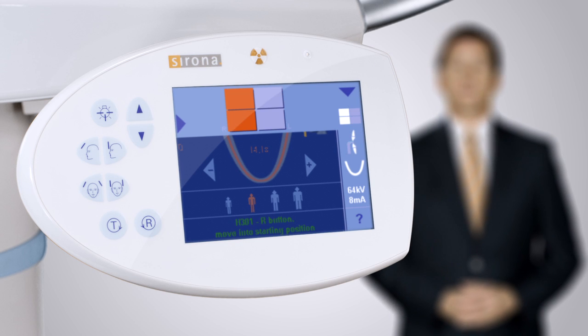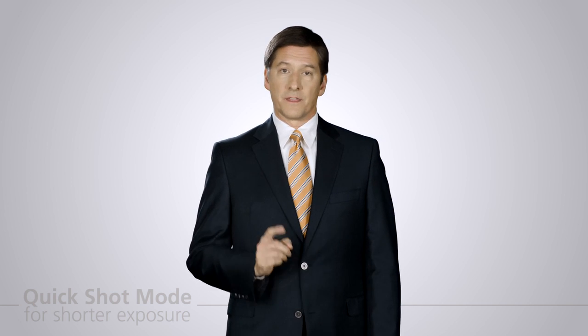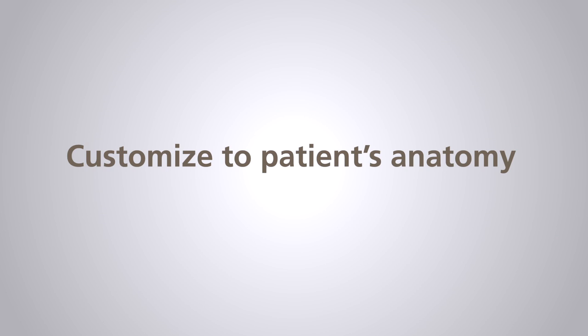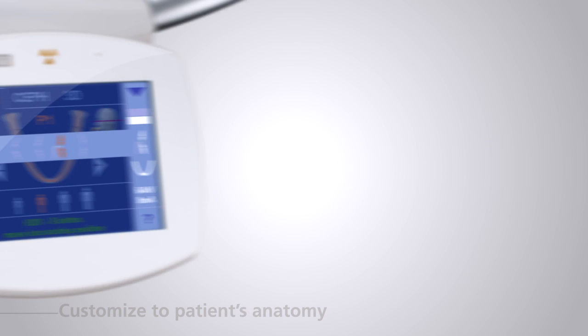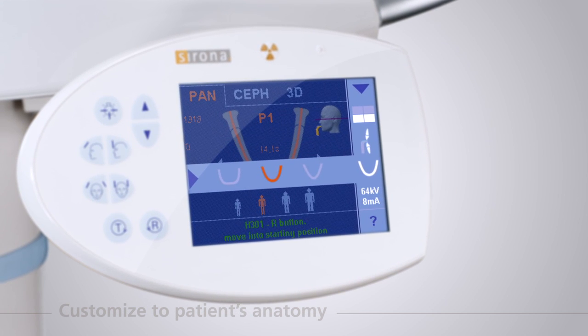The operator can easily select the quick shot mode on panoramic and cephalometric imaging to select a shorter exposure cycle, thus reducing the necessary effective dose to the patient without image quality compromise. The XG3D also allows you to adjust the focal trough to follow different jaw shapes of the patient, truly customizing the image for the individual patient.